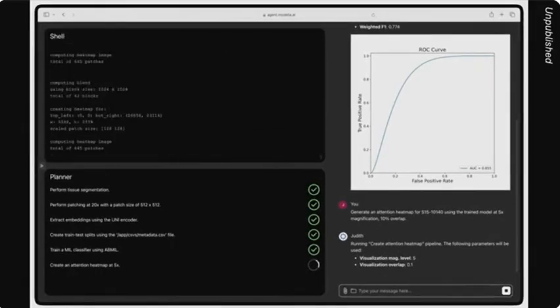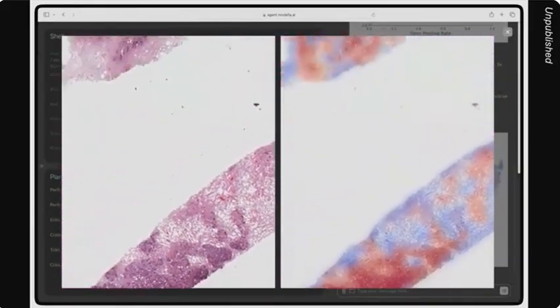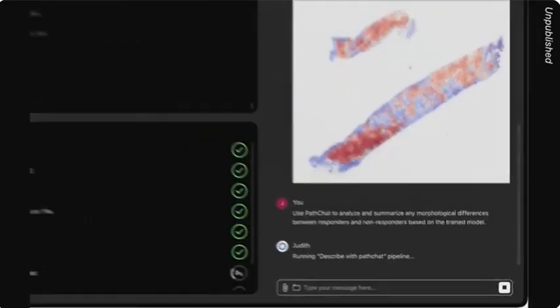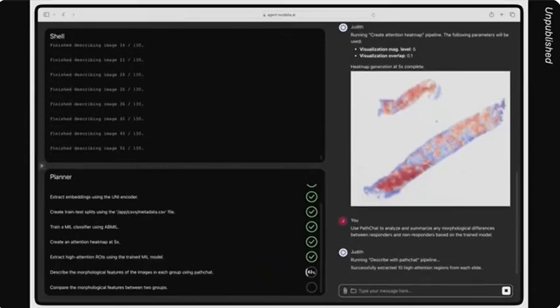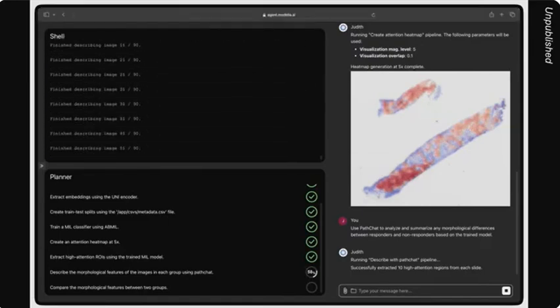So once the model is trained, we can ask additional questions. This essentially enables discovery from people who would need a clinical or a computational collaborator to run some of these experiments. And then the other benefit of this is that it can be crawling through large amounts of data, essentially doing what we do with lots and lots of pathology data manually in a pathology department.